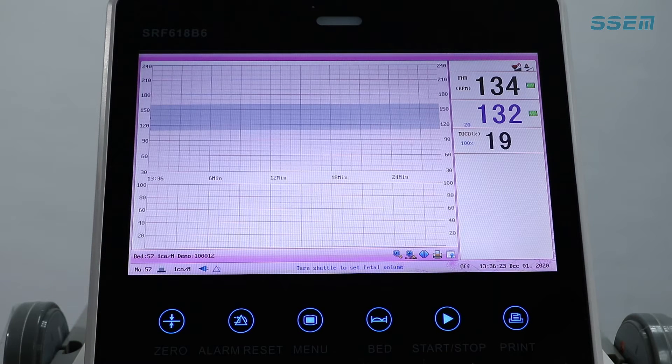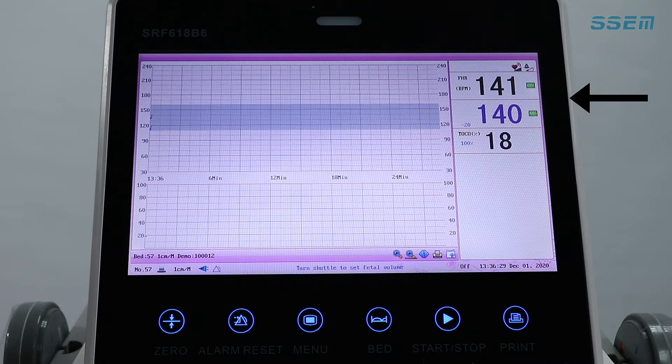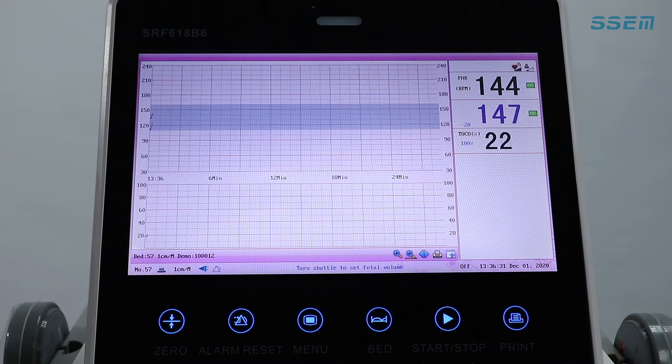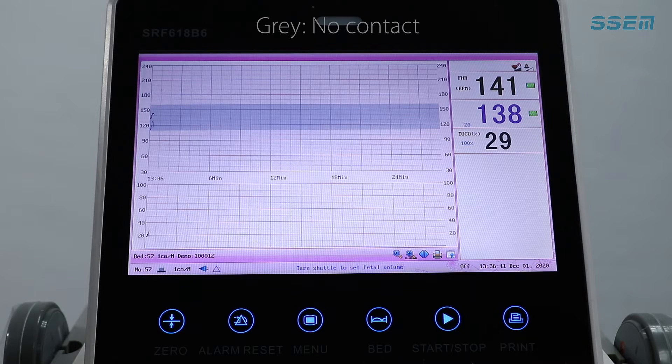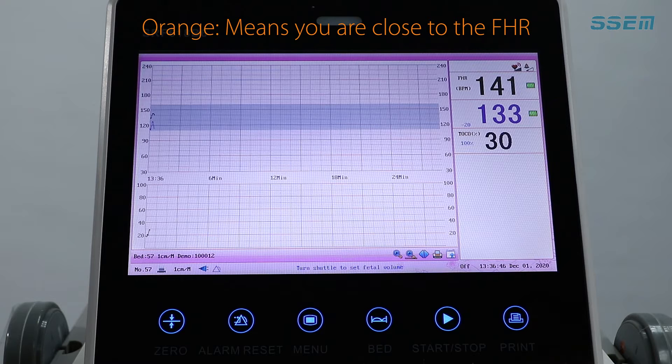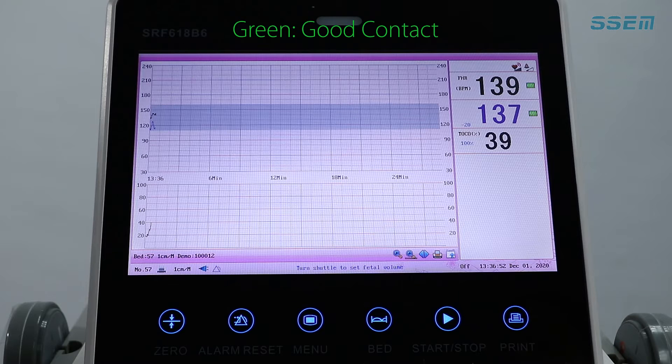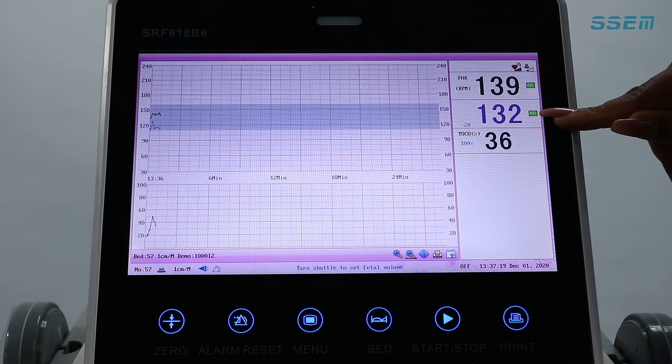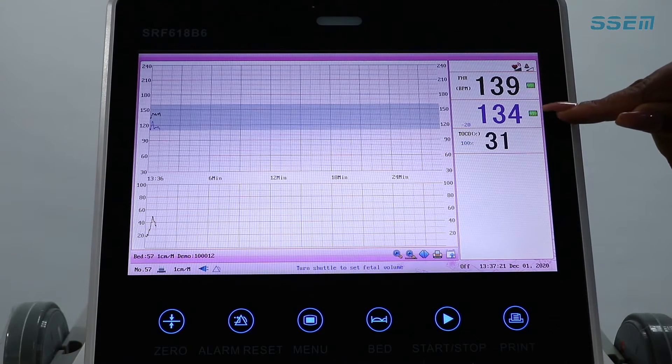Press the start button and place the transducers onto your patient. Observe the connection indicators for the FHR placements. Gray would mean that you have no connection. Orange means you are close to the FHR patient device connection. Green means good contact. These are the FHR connection indicators.